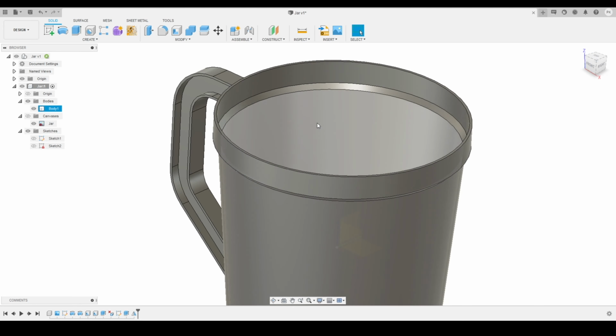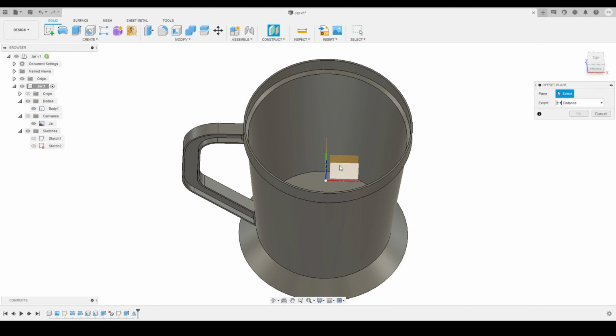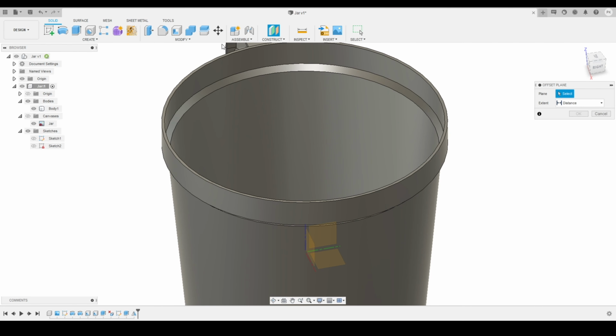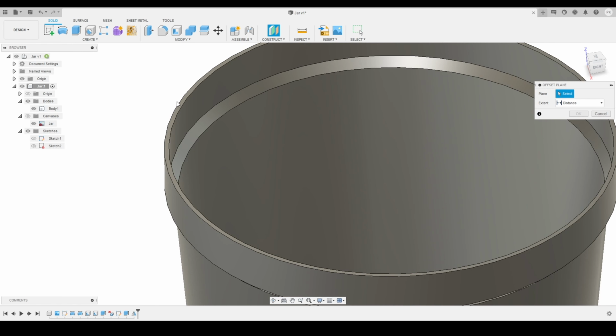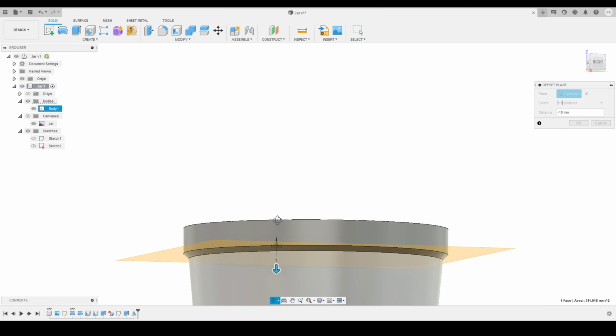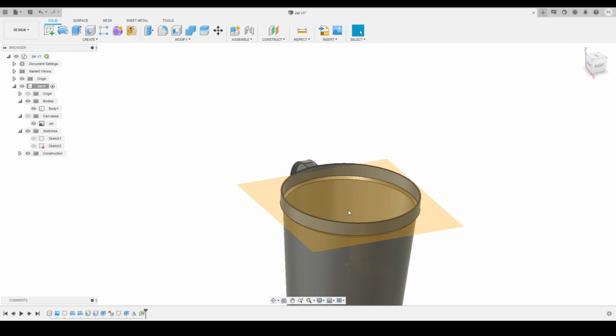Our next thing will be creating the thread on this face, which we can do using a trick. So now we'll go to the offset plane tool. We are going to create a new plane at a particular height, so we'll activate the tool, select this face, and offset this face plane by minus 10 millimeter. Here you can see this is the position of the plane, and we'll press OK. So you can see this is the new plane that we created.